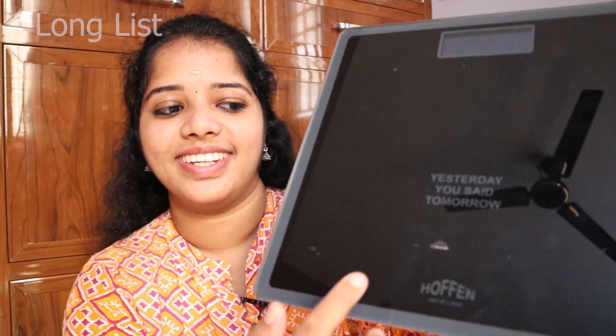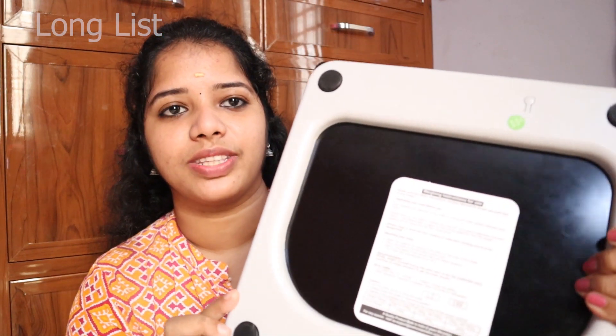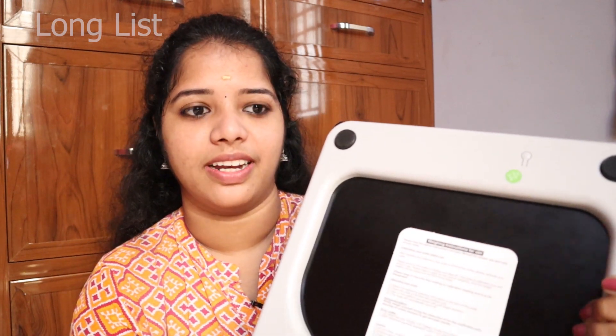There is a motivational quote on the scale. You can also see the brand name, and turn it to the back side. There are 4 sensors on the back side. You can weigh in kg, pounds, or stone, and change the unit using the button.